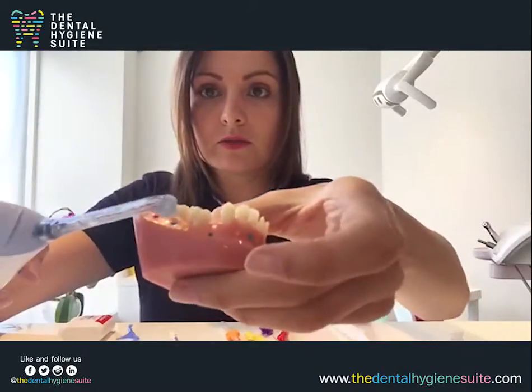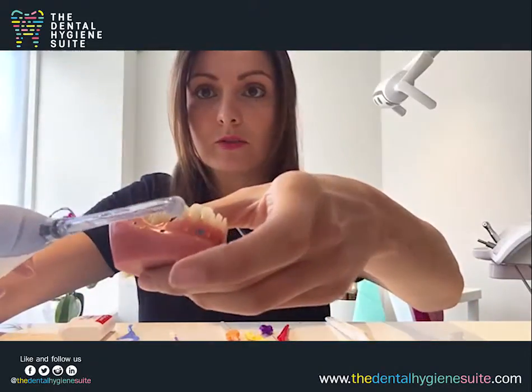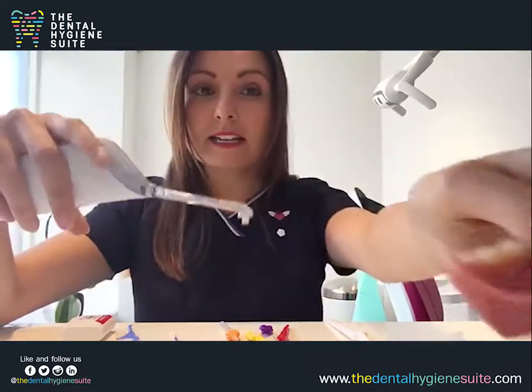Now if you don't like any of those, we have got this, it's quite new actually, it's called an Air Floss Pro, and they can be quite expensive, but they're brilliant at removing the food debris, keeping the bleeding down, and it will inevitably prevent you from having gum disease, cavities forming, so it's a really good investment actually. So I'm just going to show you. So you turn it on at the back, you fill it with mouthwash or water, and I'll show you when you press the button, it just sprays air and water really fast, and you put the nozzle in between the gaps and you just spray all the way around just like that. So really easy if you don't like any of the interdental aids or the floss.